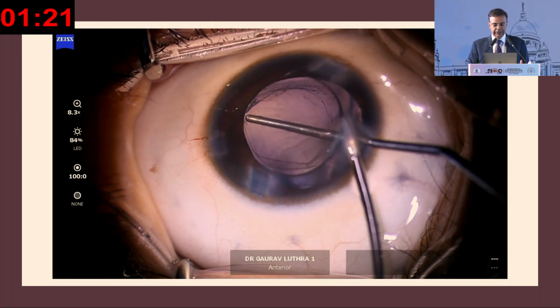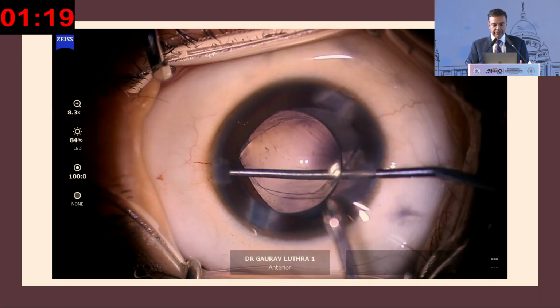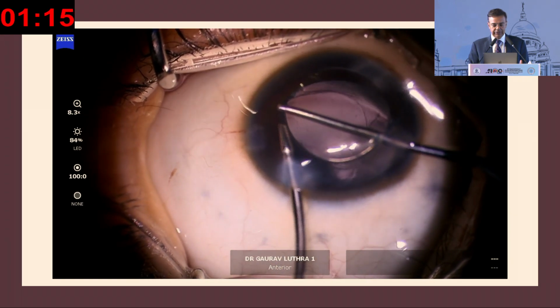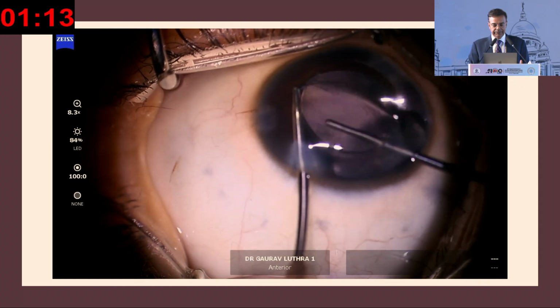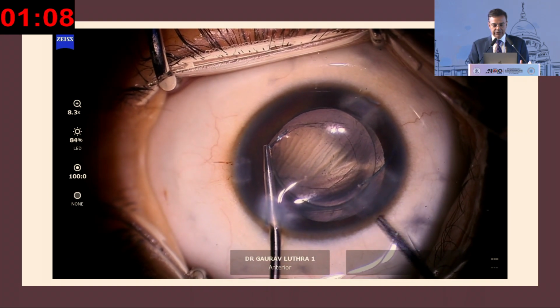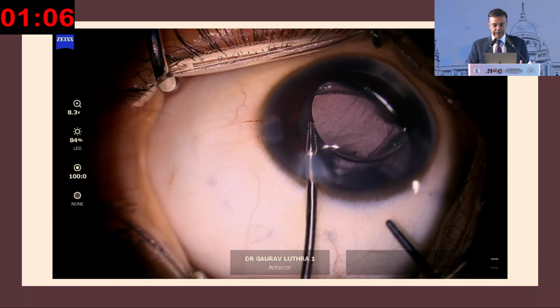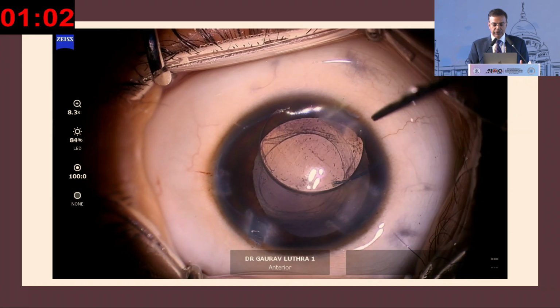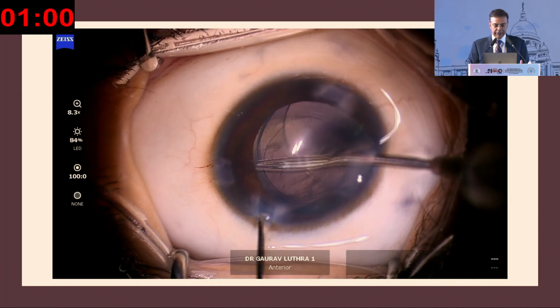So negotiating this optic anterior to the rhexis, changing hands, and now going from the other side with the dial forceps and getting a grip on the second haptic, and now I'm secure. So I'll just have to dial that out and position this IOL into the sulcus. So you have to be prepared, and the correct instrumentation plays a big role.